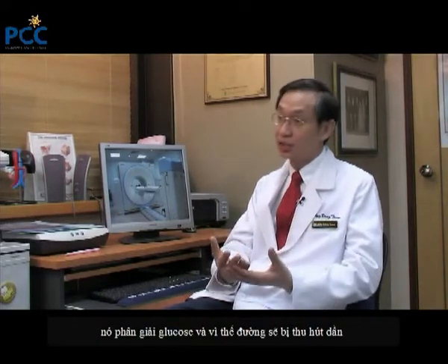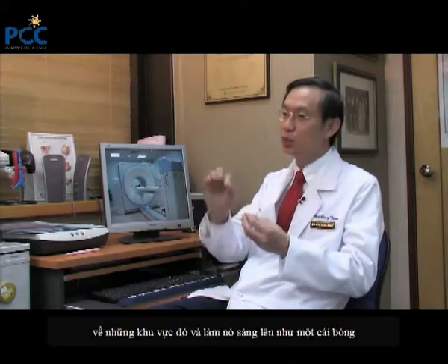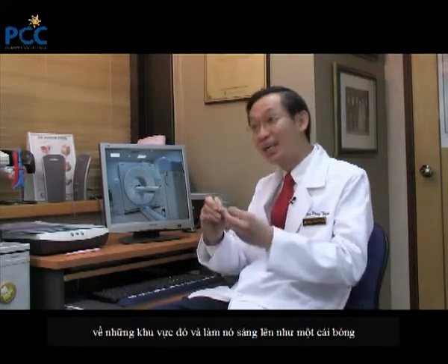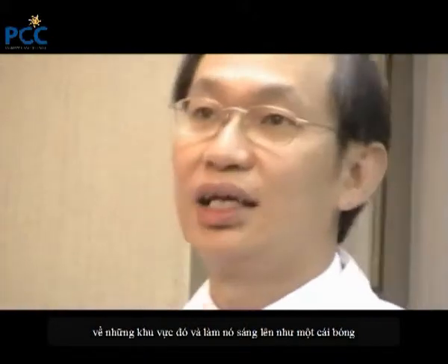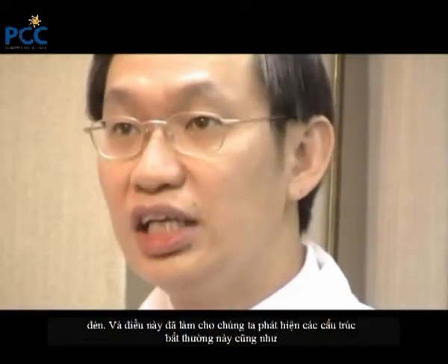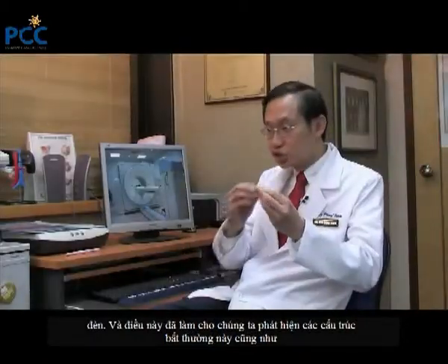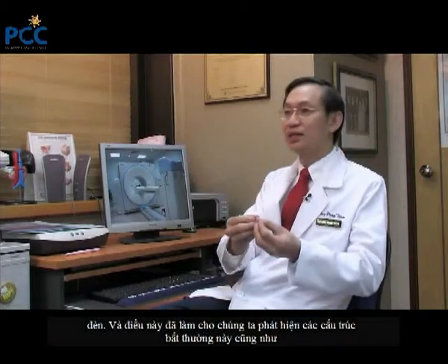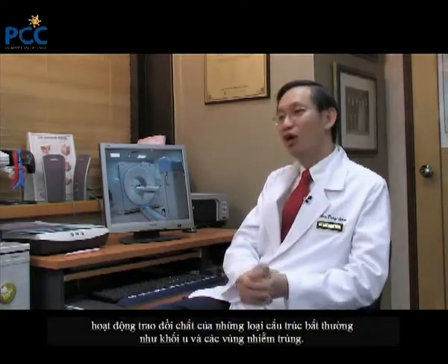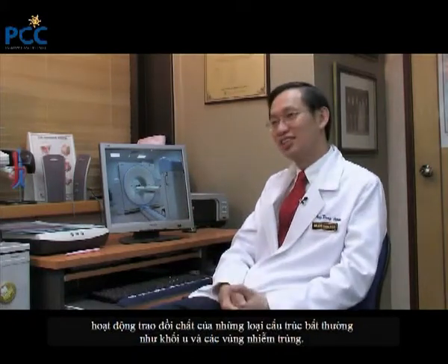It metabolizes glucose. And therefore, the sugar preferentially will go to these areas and light it up like a light bulb. And this has made a great deal of difference in the way in which we can study the structural as well as the metabolic activity of various abnormalities like tumors and infection.